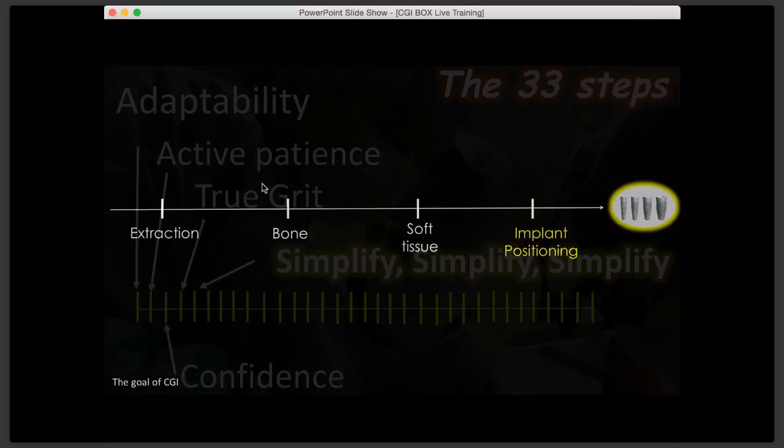Now, you can also think about buying an optical scanner, not to take physical impressions, and I think that's a great idea. They're already digital. You don't have to digitize anything. There's not too much distortion. And I'm planning to buy one myself. Okay, that's on my plate, and it's not $100,000. It's probably around $20,000 to $30,000. Okay, and that's still an expense, but I think it's an expense that is well worth it.